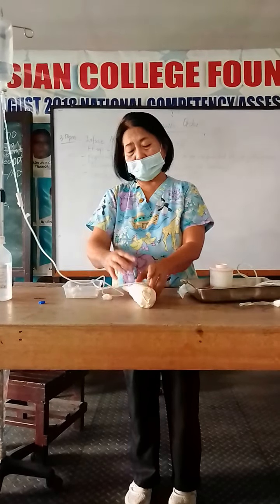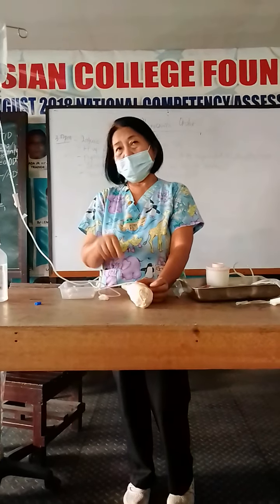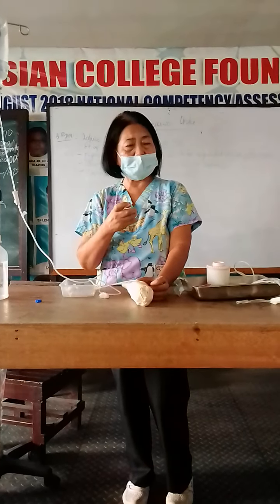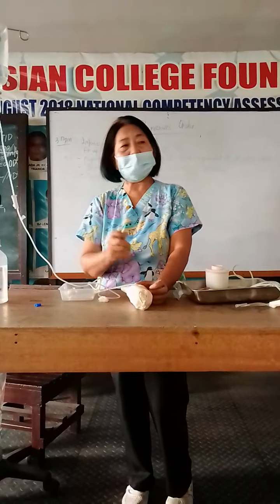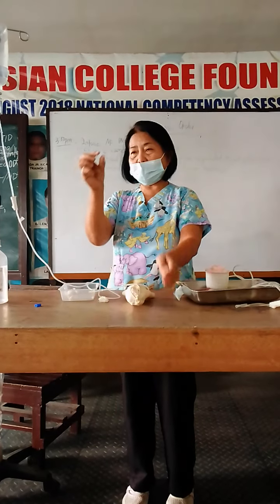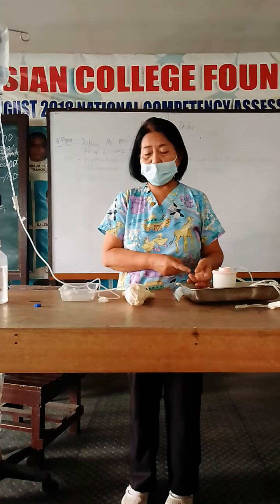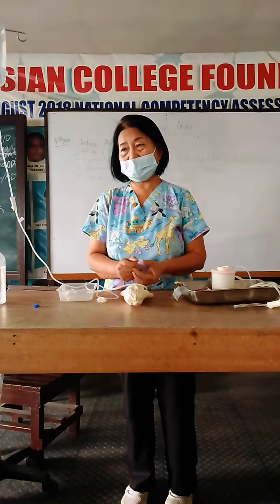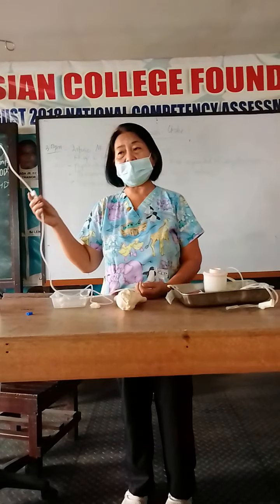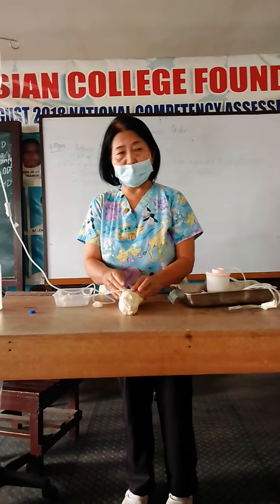So there's another technique, class, in insertion. After they have hit the vein, there is some kind of a connector that we're going to flush with distilled water. After they insert, they connect the connector, and they get sterile water. Have the sterile water ready. Then flush it before they connect the Venoclysis. That's another technique, to ensure that they are really in the vein.